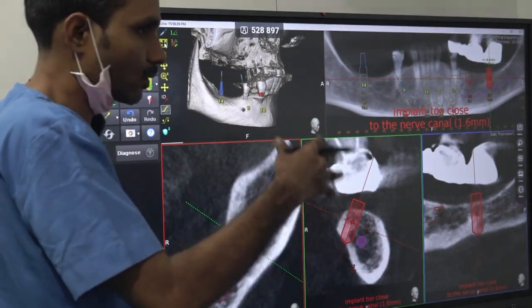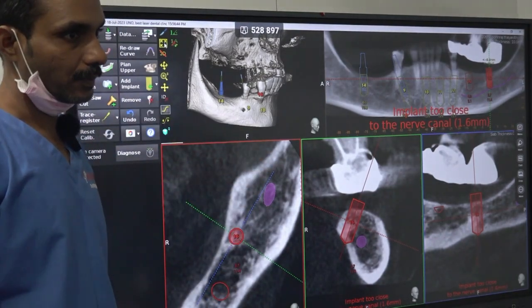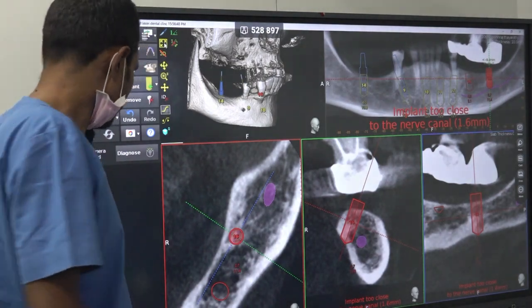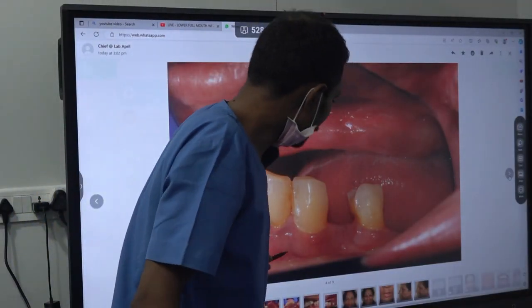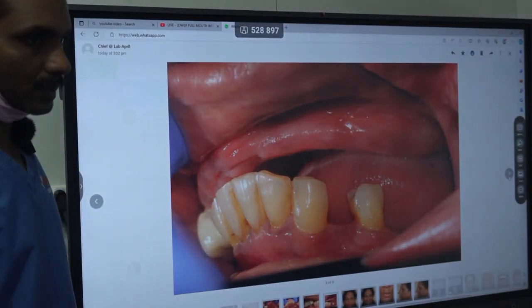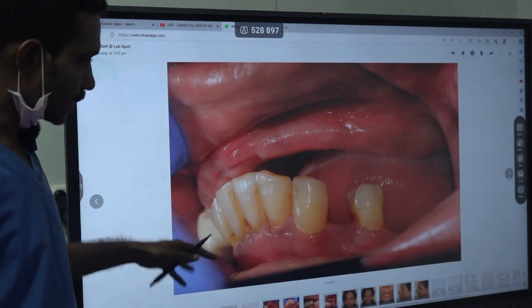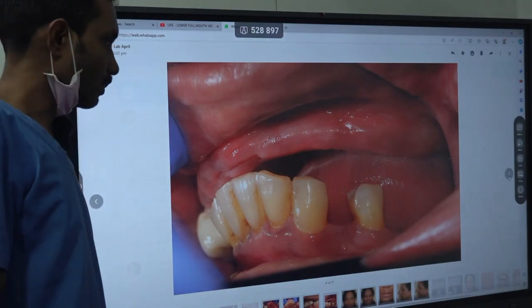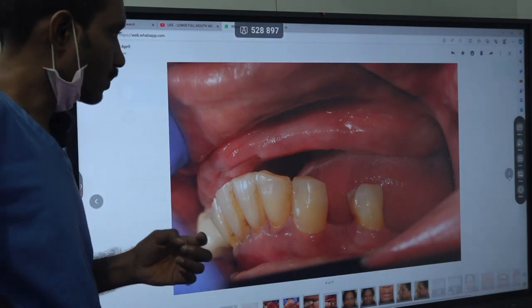So now the procedure, we have to visualize in the mind from start to end. What are all the challenges we may see here? What is the extensive alveoplasty we have to do? And we don't know how much attached gingiva this patient is having. Okay. Some good attached gingiva only. Flap reflection will be easy only. And alveoplasty difficulties, we have to list out. Extraction, there may not be any difficulties as the teeth are predominantly weak only. Okay, bleeding also there may not be any issues, it is not very severe gingival inflammation.